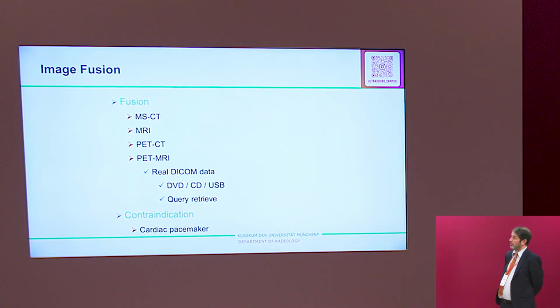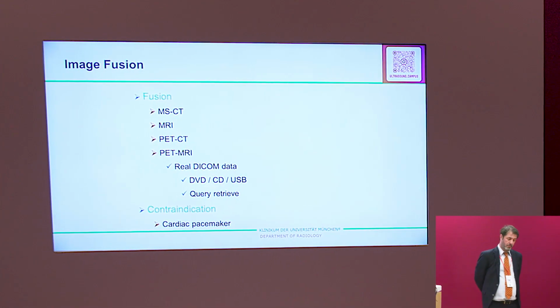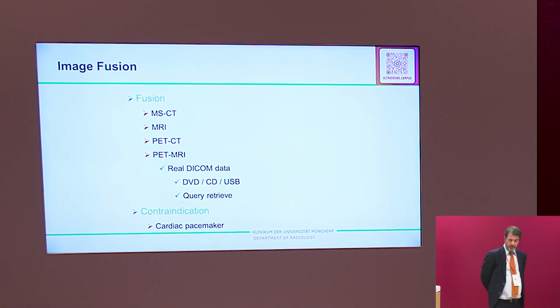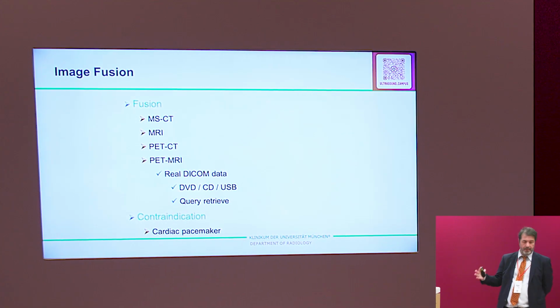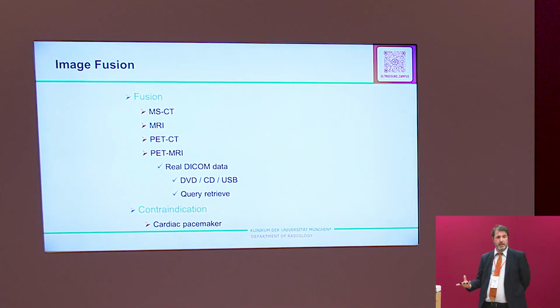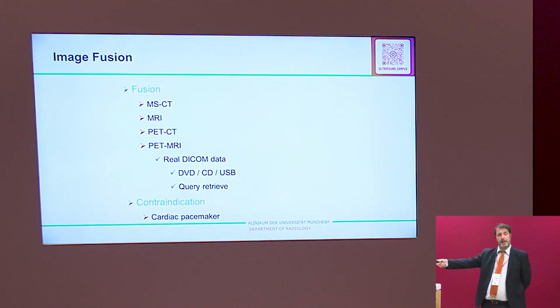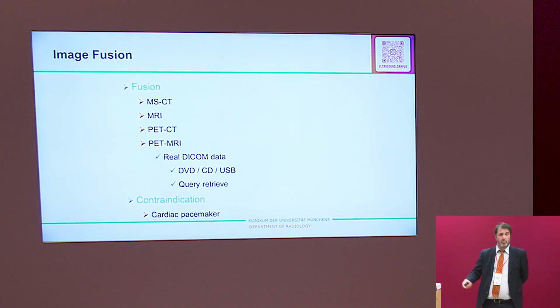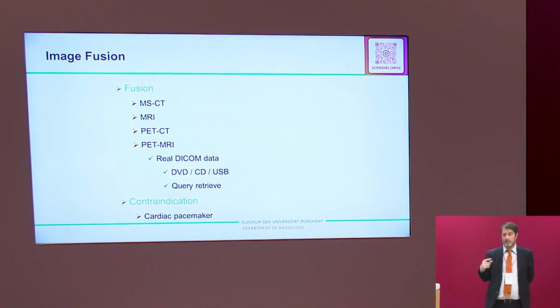First of all, you have to make a decision what kind of modality you would like to use. If you go to a radiology department and you receive whatever MRI or CT, you normally get the patient data on a CD or DVD. You can use this DVD and directly upload it on the system. You can also upload this data from the PACS to the system.